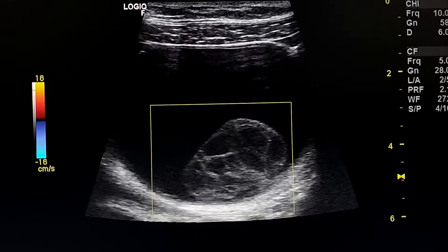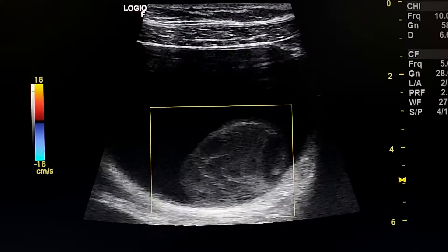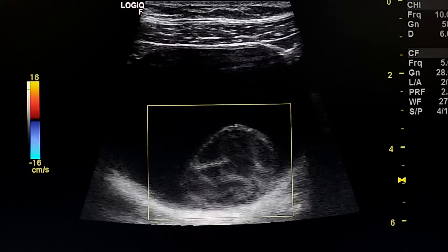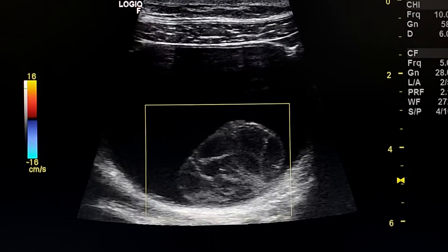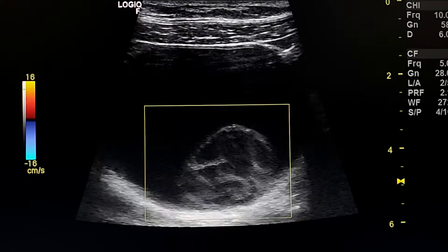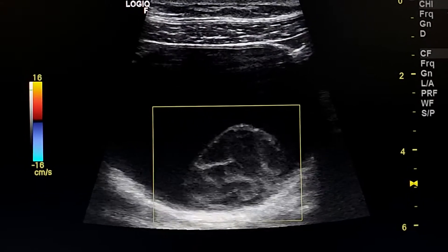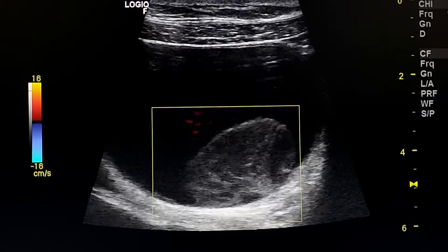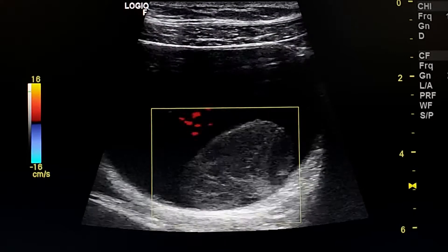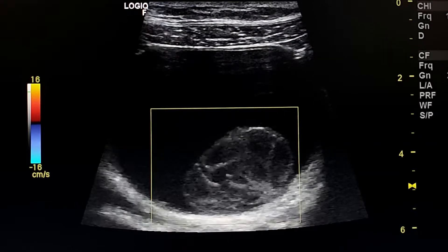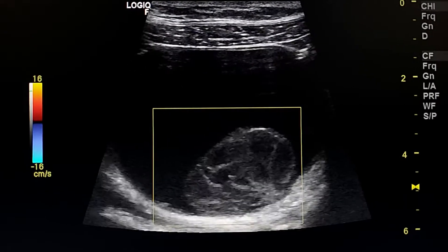By color Doppler, we can confirm that this is not a mural tissue nodule by demonstrating no vascularity in this lesion.